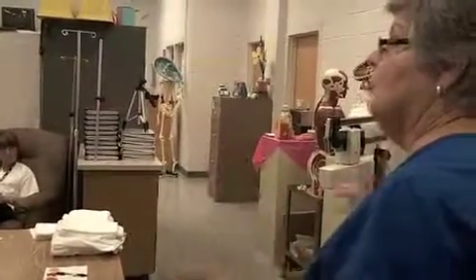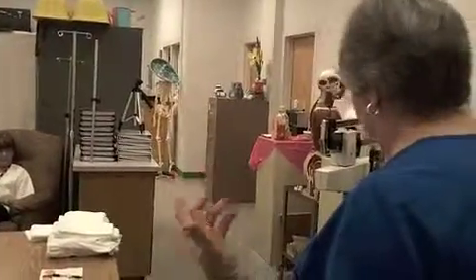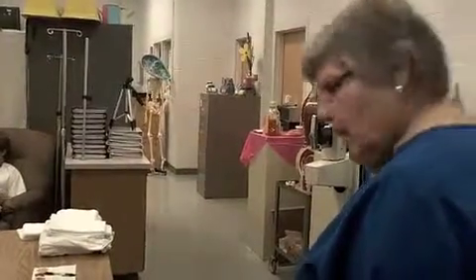I know that in real life you want to move it back to 0 because you don't want somebody walking up there and saying, "Oh, I know Beth's weight now. Because she just got off that scale. I know her weight now." So you're exactly right. In teaching, yes, but for testing, leave it where it's at. Good question. Okay, what's next? Range of motion, ankle. Range of motion ankle.